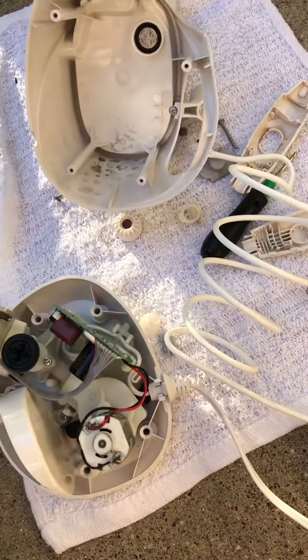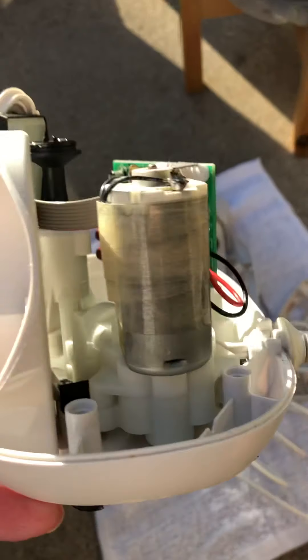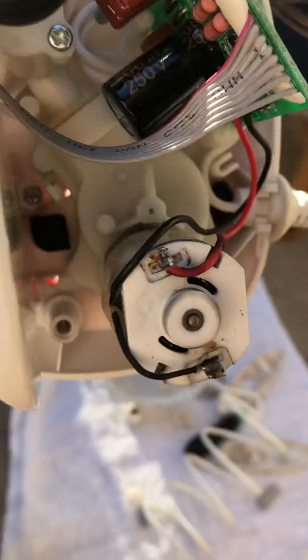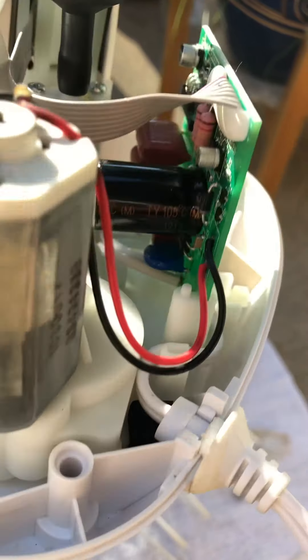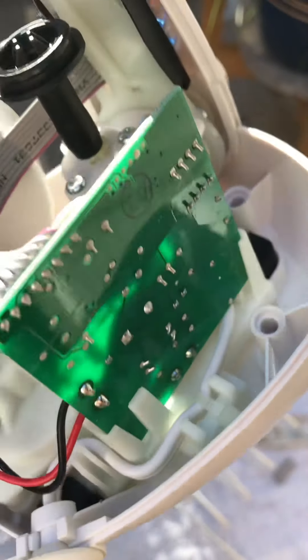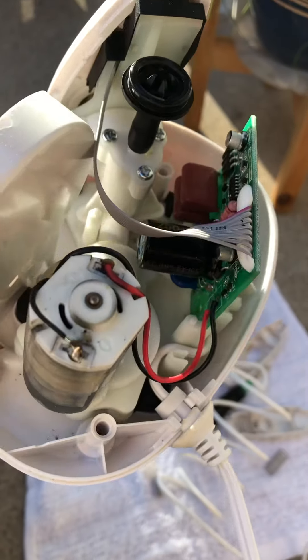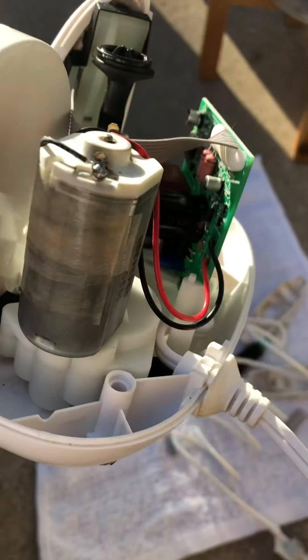Just in case anybody wanted to see the inside of this thing, I went ahead and took it all the way apart. There is nothing really to see in here — it's clean. Everything seems to be in good order here.